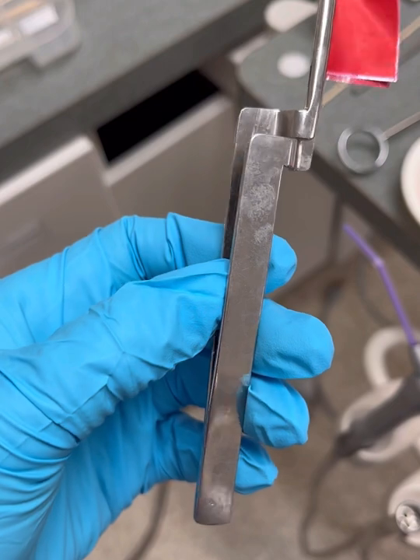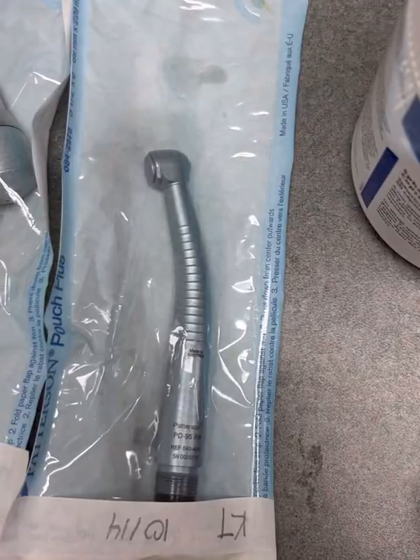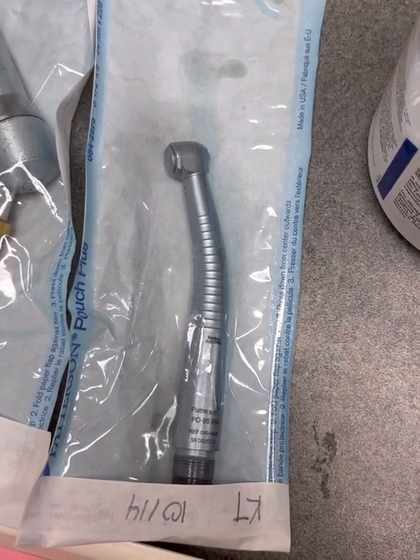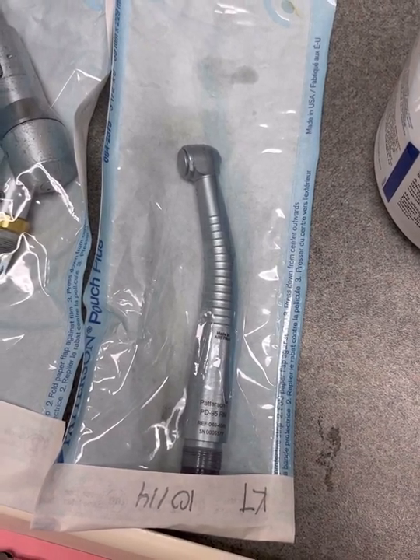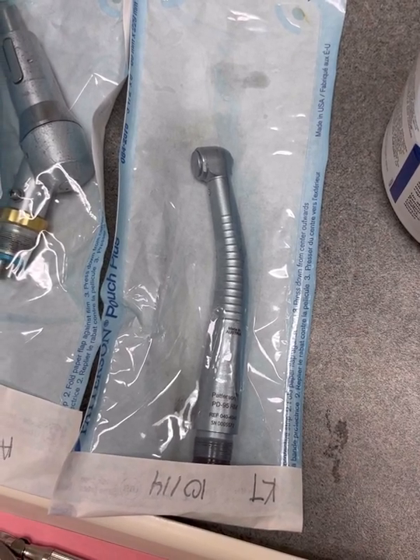And then you can transfer articulating paper with the holder until marks are even throughout. You will finish the restoration with a sandpaper disc or a polishing stone with a slow speed. Then you will wipe all the blue marks from the teeth that the articulating paper holder left. Give the patient a full mouth rinse.